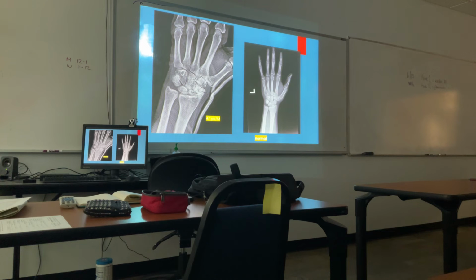Normal, not normal. So sometimes you'll be asked to x-ray a person who has a cast on because they've had previous trauma. Okay, how old? 47. 47. Horrible letters. Thank you, 47. Why did they x-ray him and put him in a cast? Because, make sure everything's healing properly. Okay, but before we assume that everything's healing properly, why do we put people in casts? Fracture. For stability for fracture.